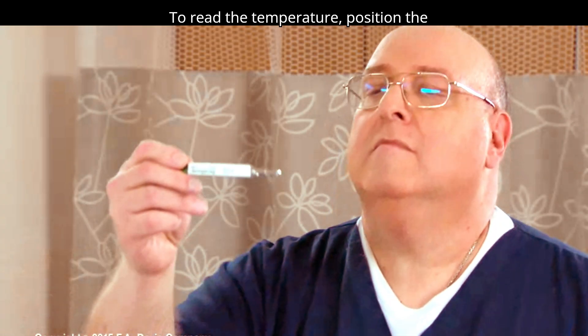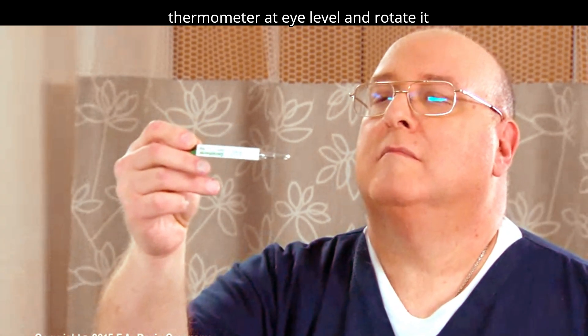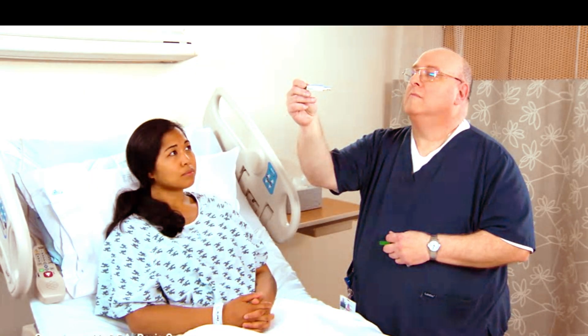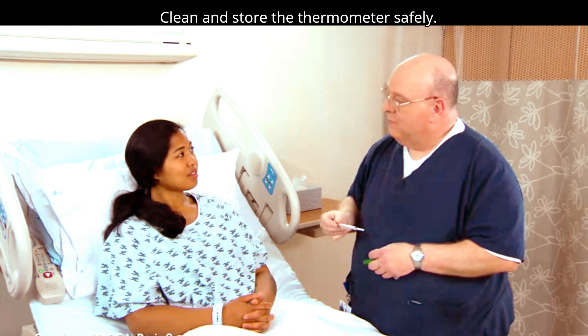To read the temperature, position the thermometer at eye level and rotate it until the markings are clear. Clean and store the thermometer safely.